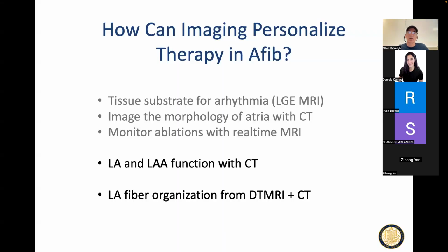Oh, okay. So the next application I wanted to look at is atrial fibrillation, and can we say anything, if we have their CT cine, can we make some statement about this person's risk for stroke if they're in AFib or they're coming in and out of AFib? Are they somebody you should put on, say, warfarin or some blood thinning drug so that they don't throw a stroke or throw a clot?